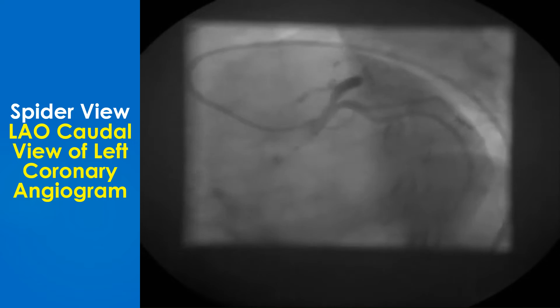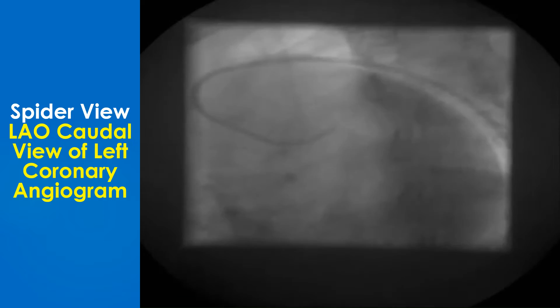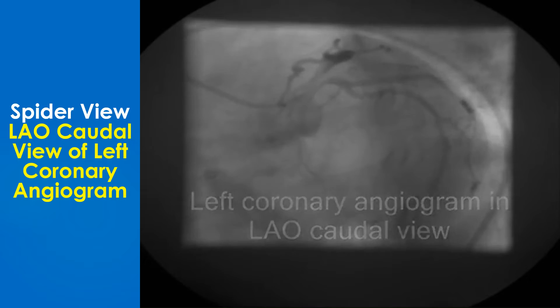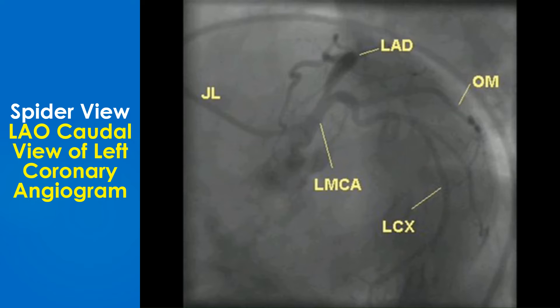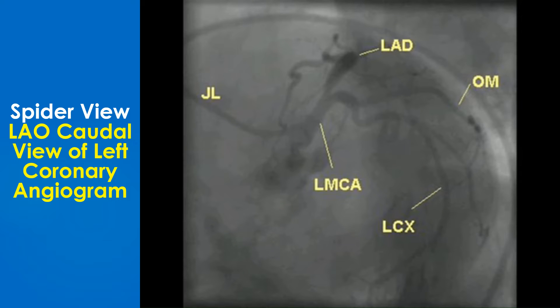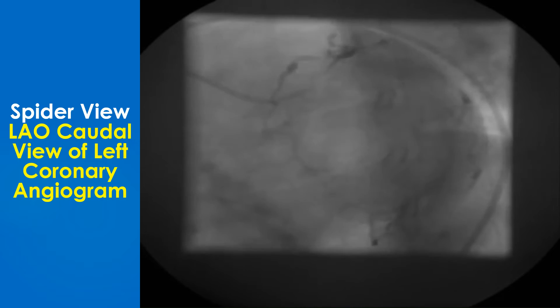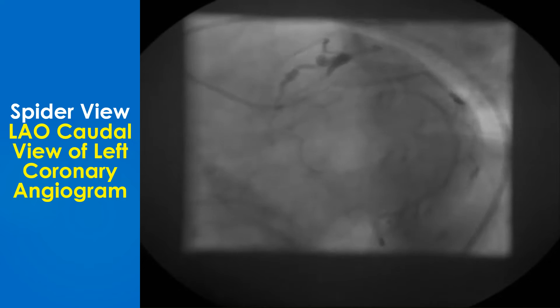Here is the scene of the left coronary angiogram in spider view. The left main coronary artery bifurcation into left anterior descending and left circumflex coronary artery is seen well. A Judkins left catheter is seen in the left coronary ostium, this being a transfemoral angiogram. The obtuse marginal branch of the left circumflex is also seen well.